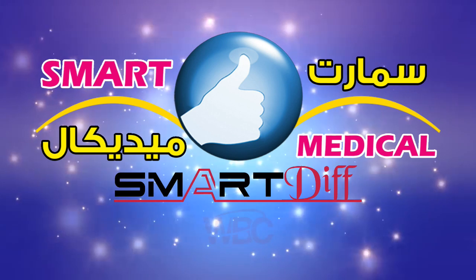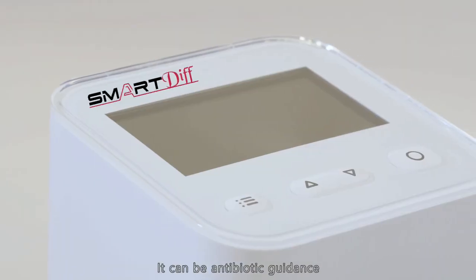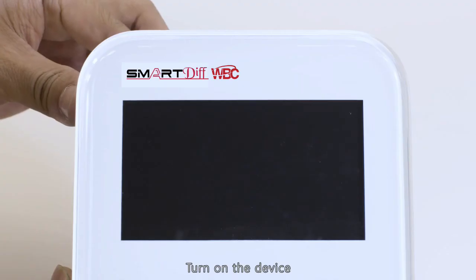The instrument is portable and compact with long-term standby. It can provide automatic guidance. Turn on the device.